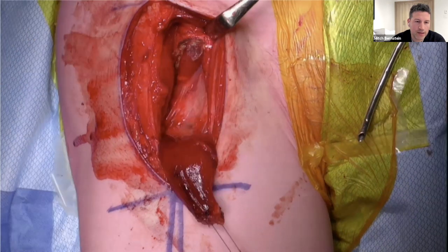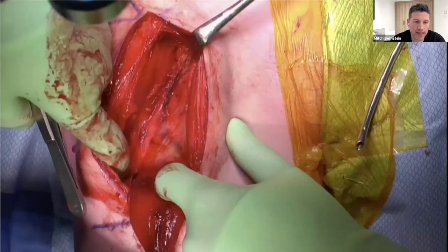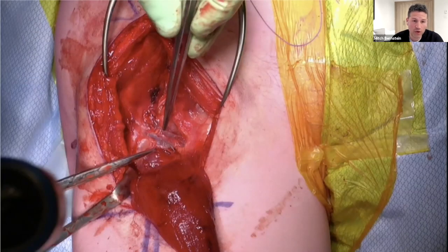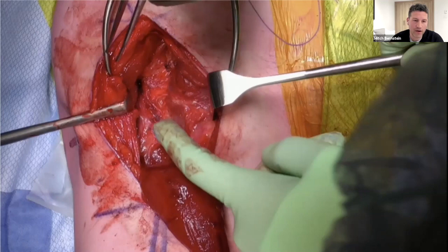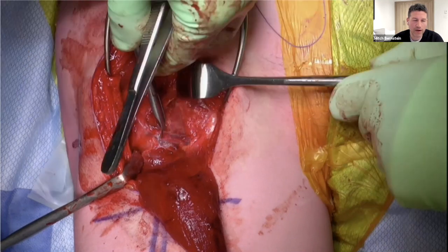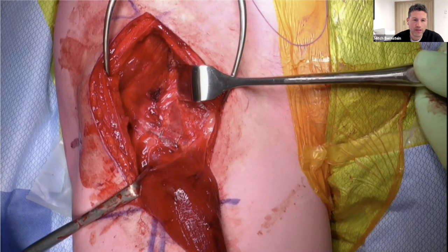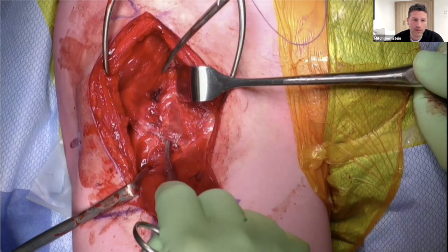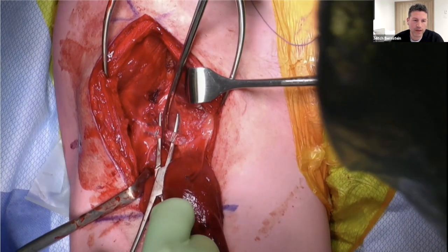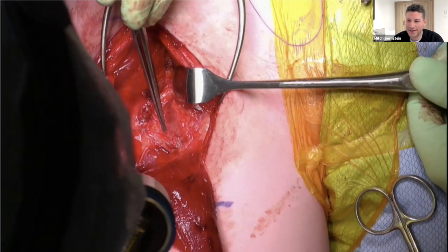It's being tagged. And deep, you'll find your circumflex vessels, which seemingly are a little distal, but if you need to work and reduce the femoral neck, these invariably have to be ligated to expose the inferior calcar area down to especially the intertrochanteric region to get clamps on and to see the reduction properly. So here we're just ligating the circumflex vessels. Just showing you that it actually is an artery.